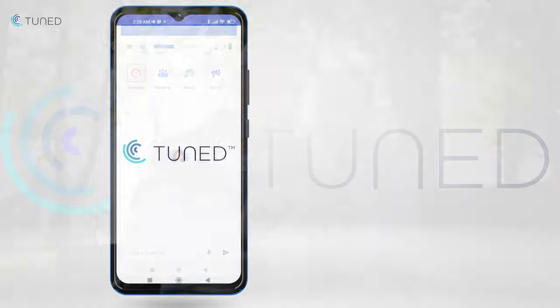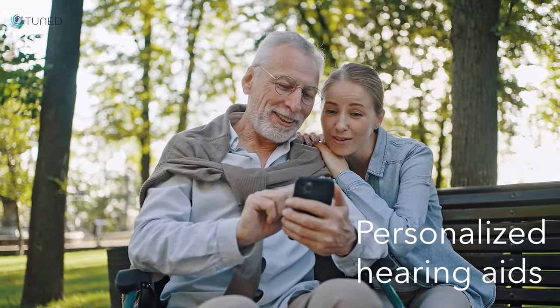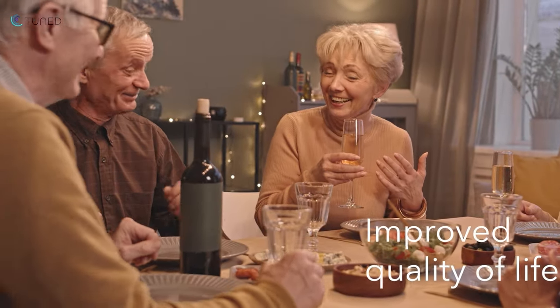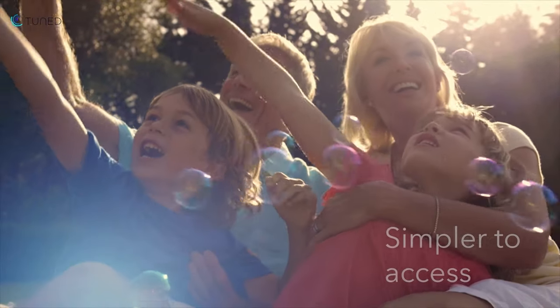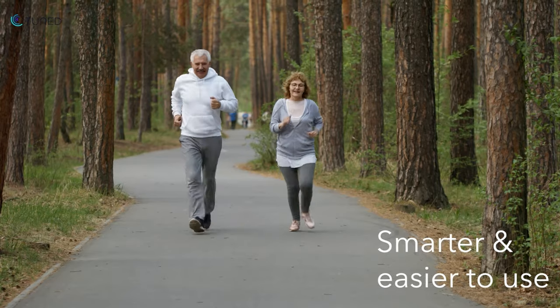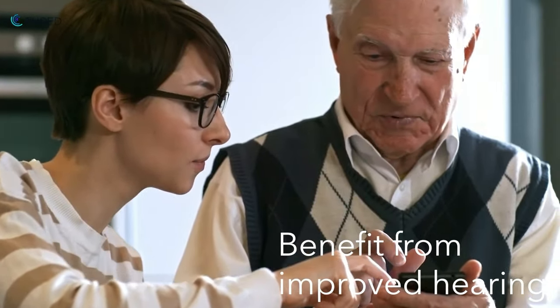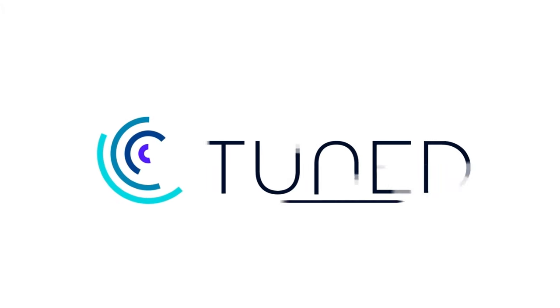That concludes the process. Our users can now take advantage of their personalized hearing aids and experience improved hearing and an improved quality of life. At Tune'd, we're dedicated to making hearing aids simpler to access and smarter and easier to use, so that anyone with hearing loss can benefit from improved hearing.